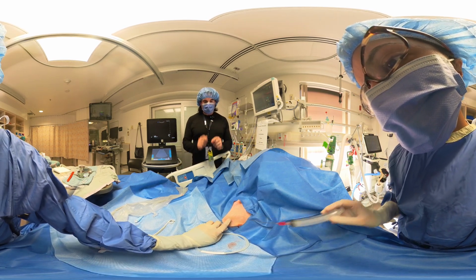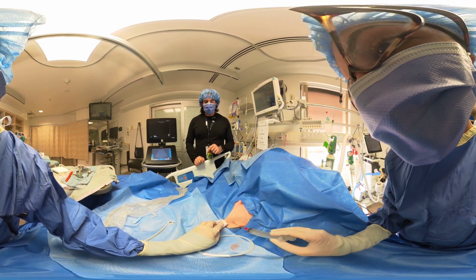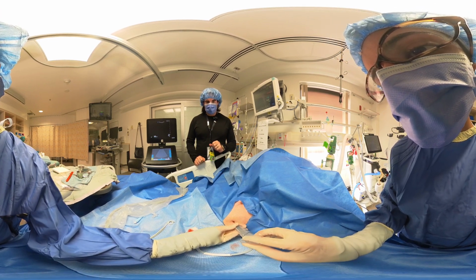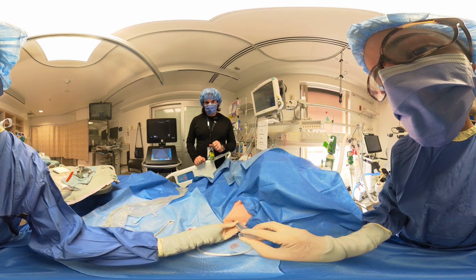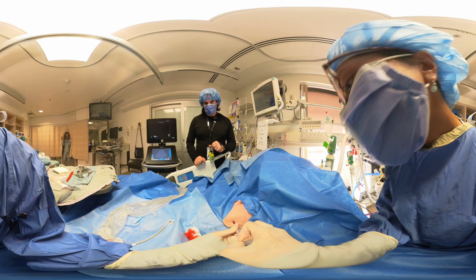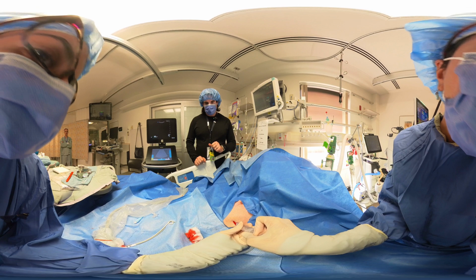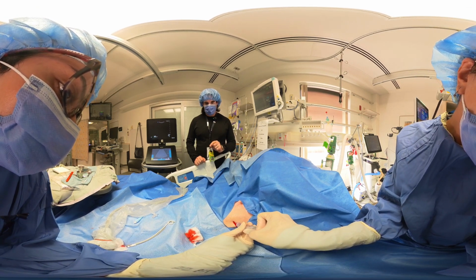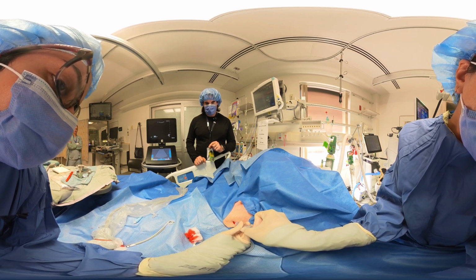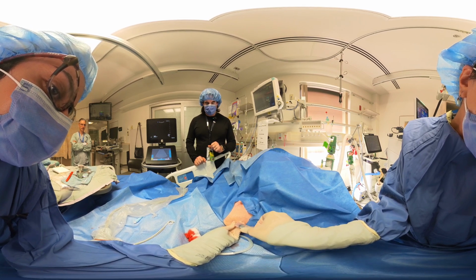Okay, so again, aim for the rib directly and then just walk over the rib, making sure you are perpendicular to the chest wall. And we're passing through our small incision here. It's looking good, it's coming. Slowly here. Yeah, keep aspirating. We'll get a nice sample here of pleural fluid.